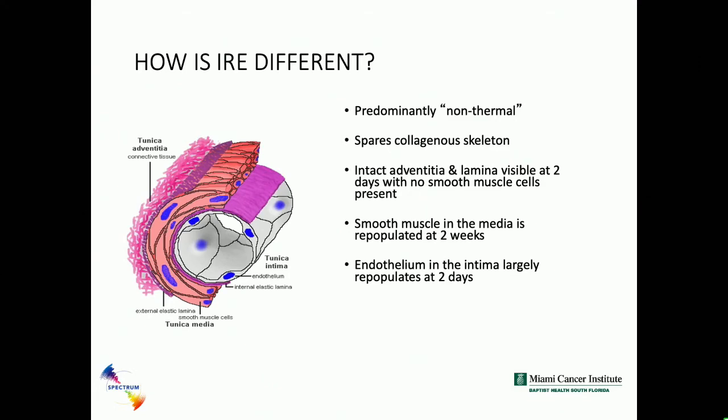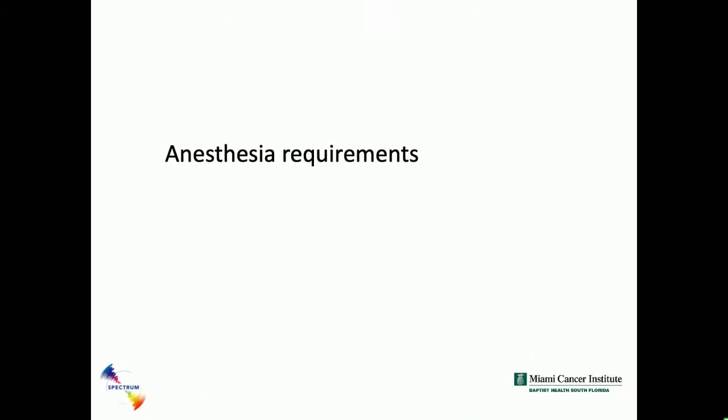Next slide, please. So this procedure has to be done under general anesthesia. You cannot do this with conscious sedation like the other ablative technologies. You can do cryo and microwave sometimes with just Versed and fentanyl, but you require complete muscle relaxation and general anesthesia for using IRE. Next slide, please.